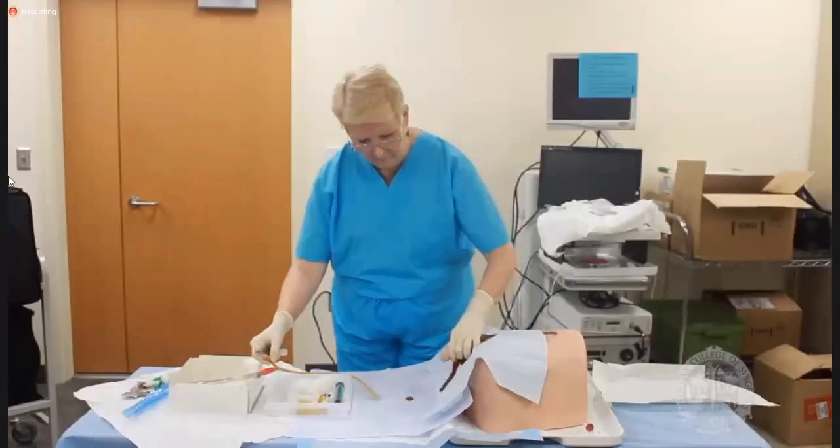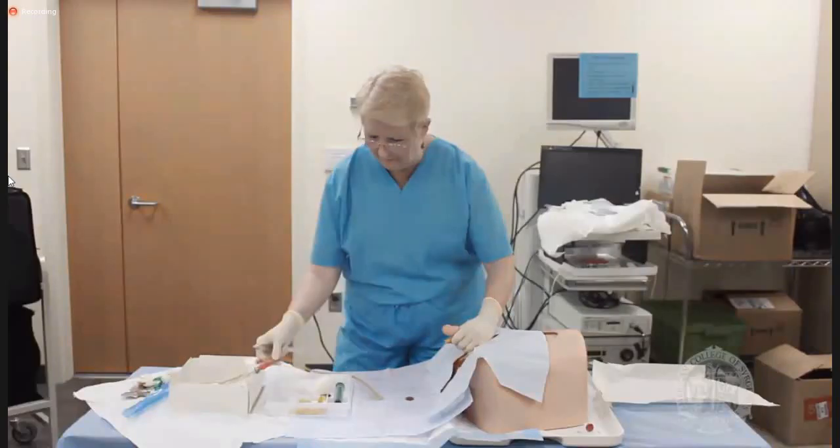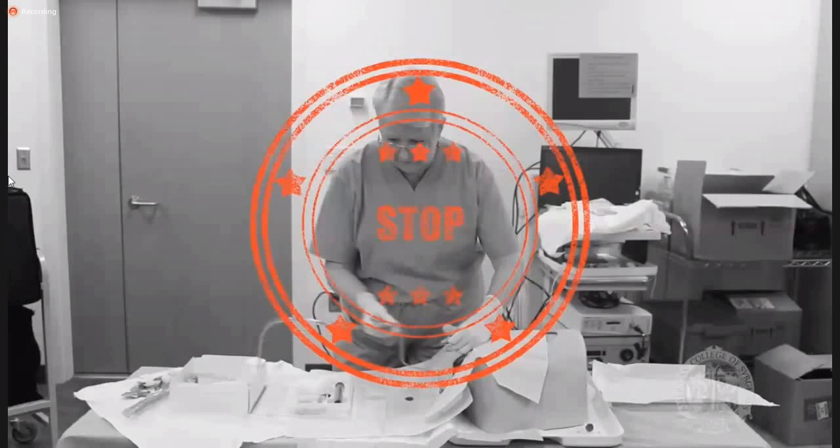By far the most common error is a break in sterile technique. Once your non-dominant hand touches the skin, it's contaminated and cannot touch any of the tubing or the catheter. Likewise, your dominant hand must stay sterile and not touch the penis or vulva or outside the sterile field. Another common complication is urethral trauma secondary to insufficient lubrication, leading to pain on insertion.